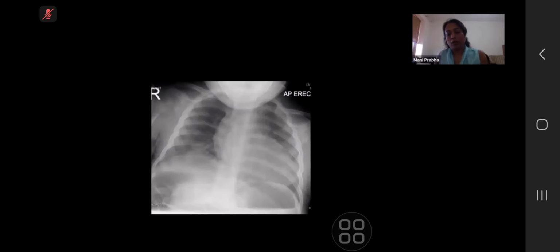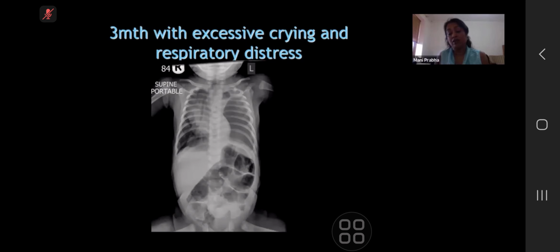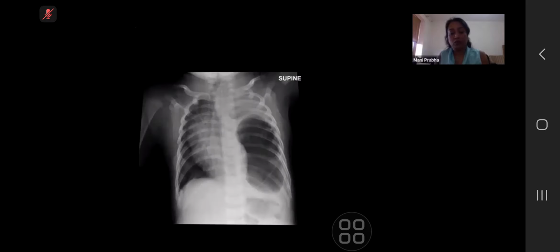Wonderful. Okay, so it is indeed a diaphragmatic hernia, slightly confusing, and this actually presented at the age of 3 months. So there was no indication in antenatal ultrasound. Usually they are detected antenatally nowadays, but there was no indication, and this child presented at 3 months. Quite confusing, but that's how we proceed: suspect diaphragmatic hernia, auscultate, do an ultrasound scan, and then put an NG tube and insufflate some air.